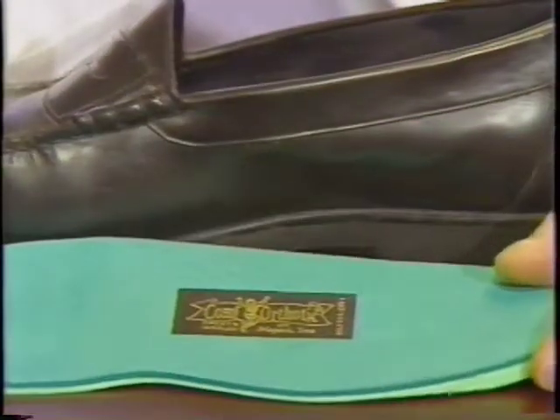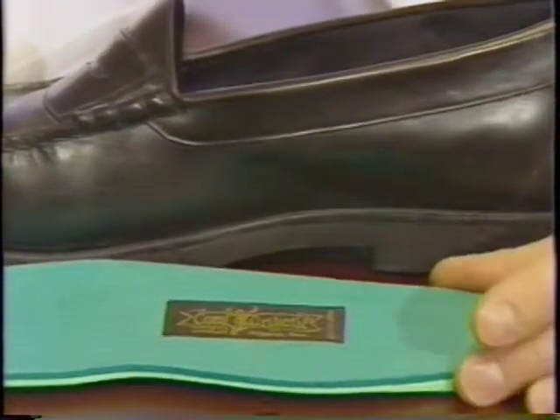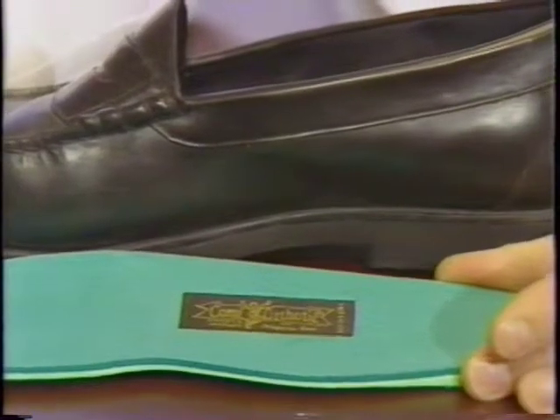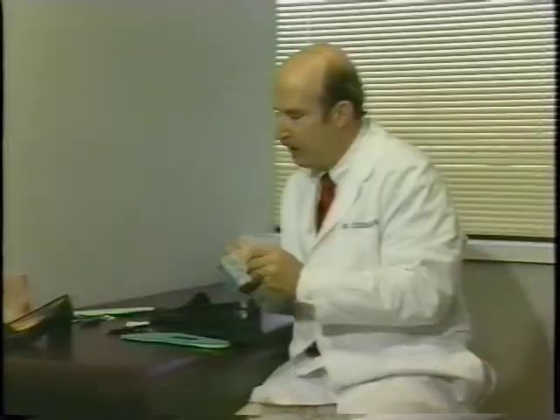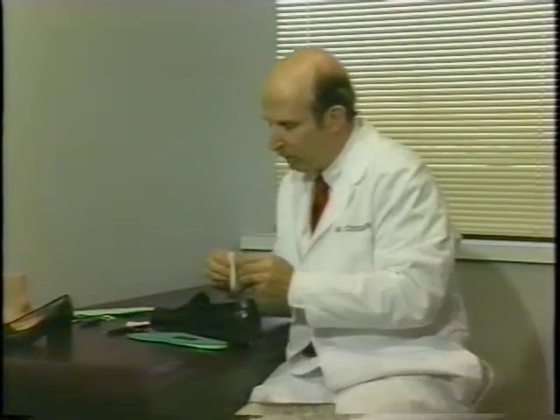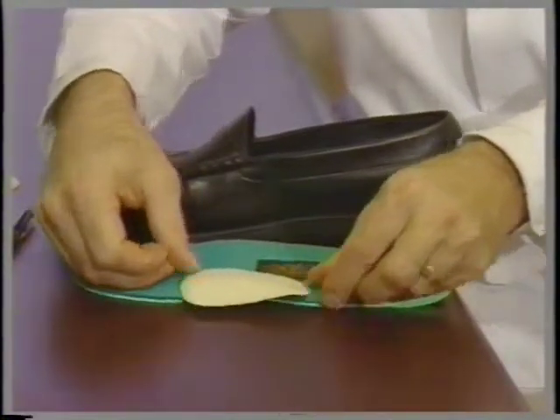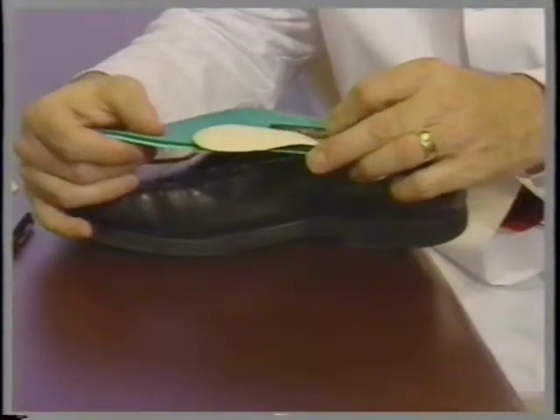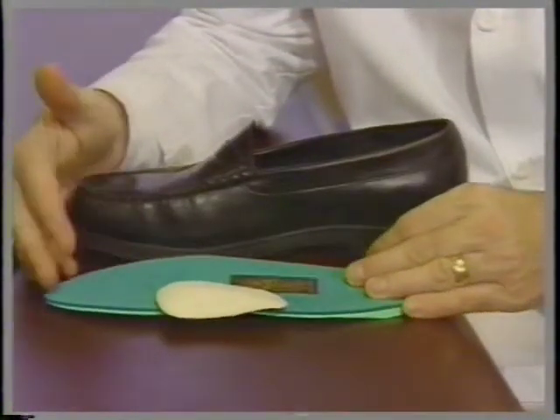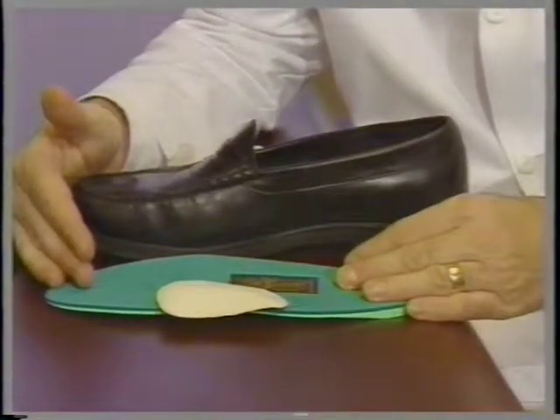Another trick in placing a pad in a sneaker: many times there are removable insoles, and you can take the insole out of the shoe, step down on it, and feel where the painful area might be. If you're placing a longitudinal arch pad, it often goes a little bit to the inner border of the insole. You can then slip the insole back into the shoe and see if you have a good fit. Some find it easier to place the pad on the insole outside the shoe first.